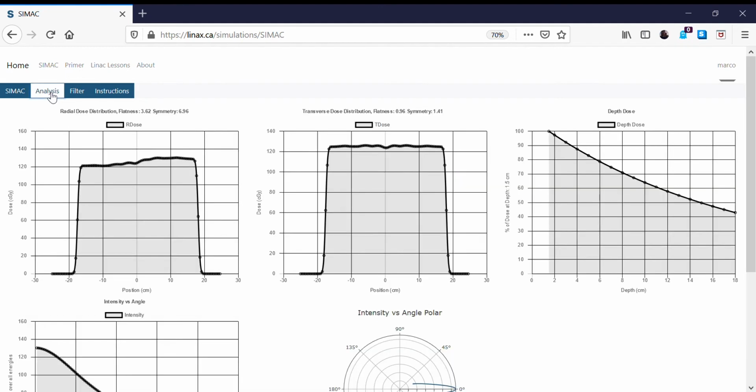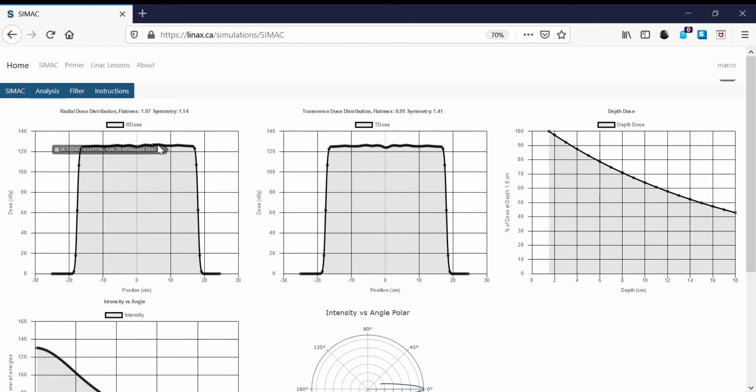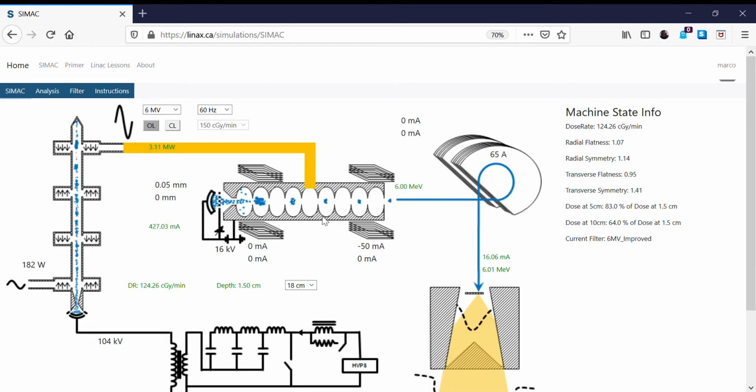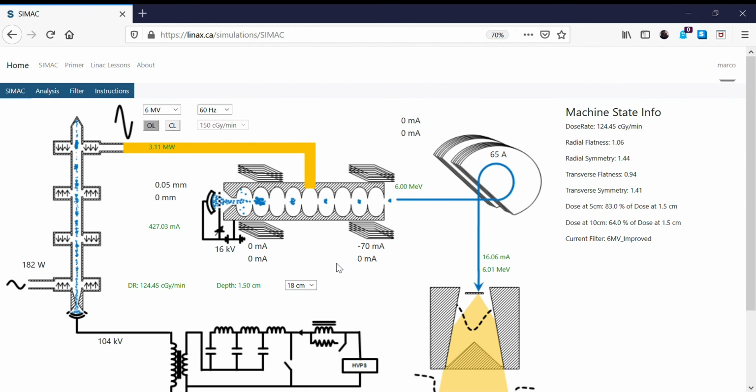Now we've steered the beam a little bit. We go back to our analysis tab, and it looks like my symmetry is worse. Before it was in the 3s, if I remember, and now it's 6, almost 7. So I've gone the wrong direction. I can come back here and make this negative, so negative 50 instead of 50. Now on the analysis tab we have a beam which is flat. I can see if I can make that a little better by increasing that number a little, say minus 70. Now it looks like it's gone a little too far the other way, so minus 50 was probably about right.